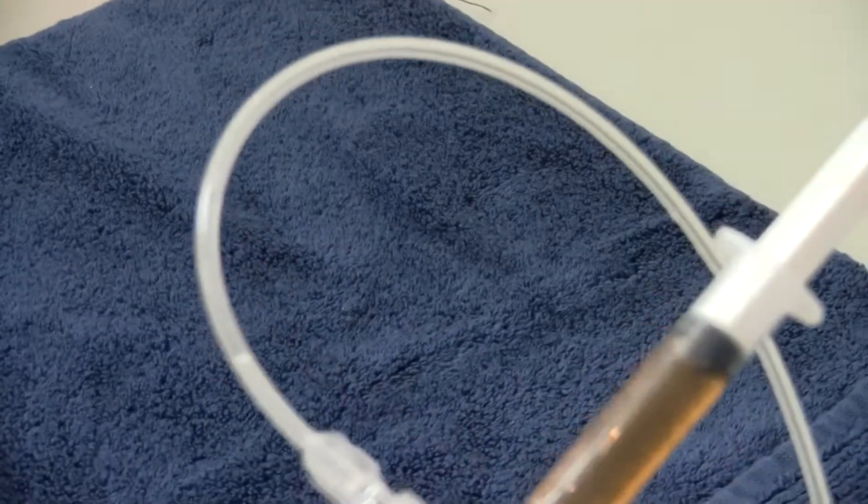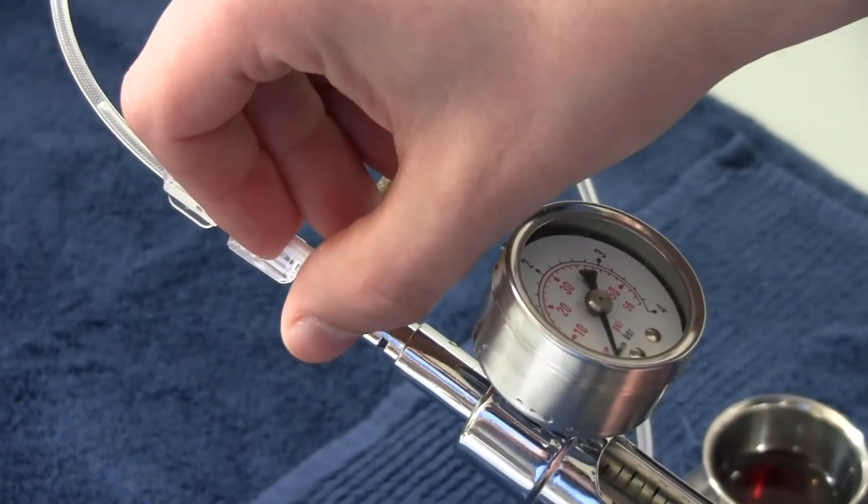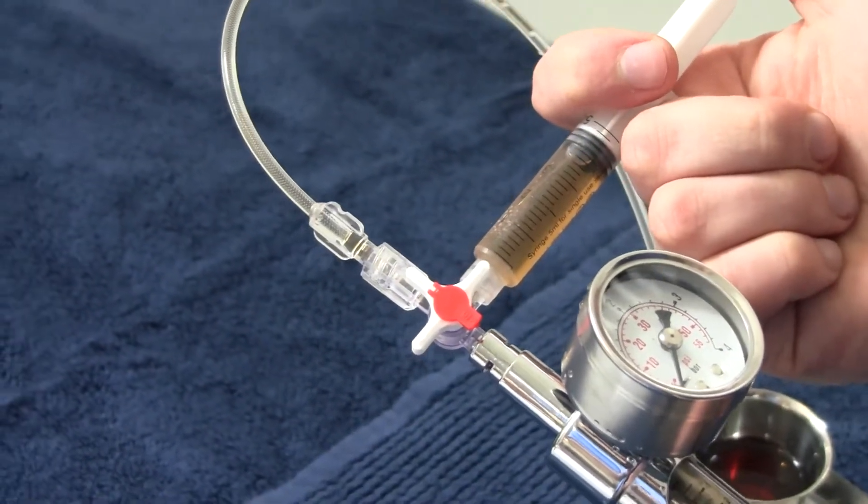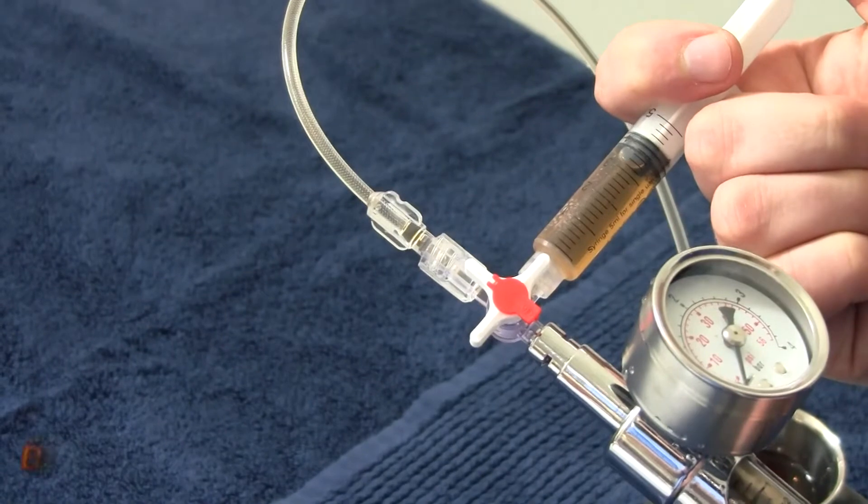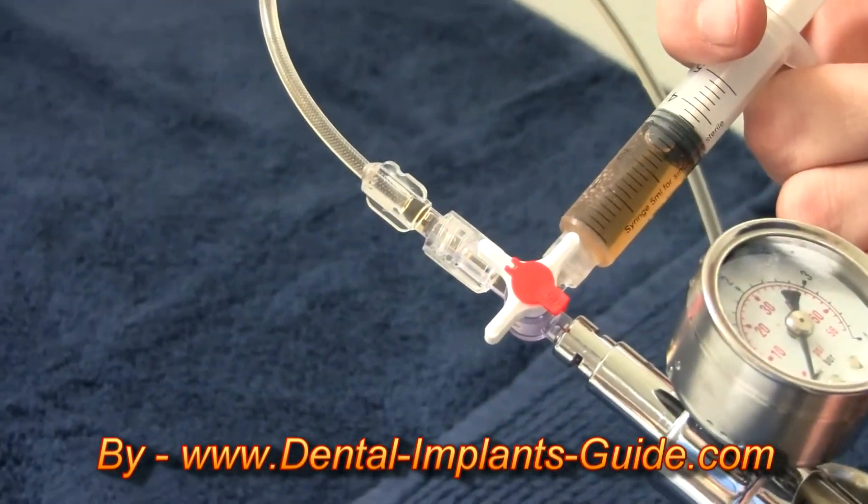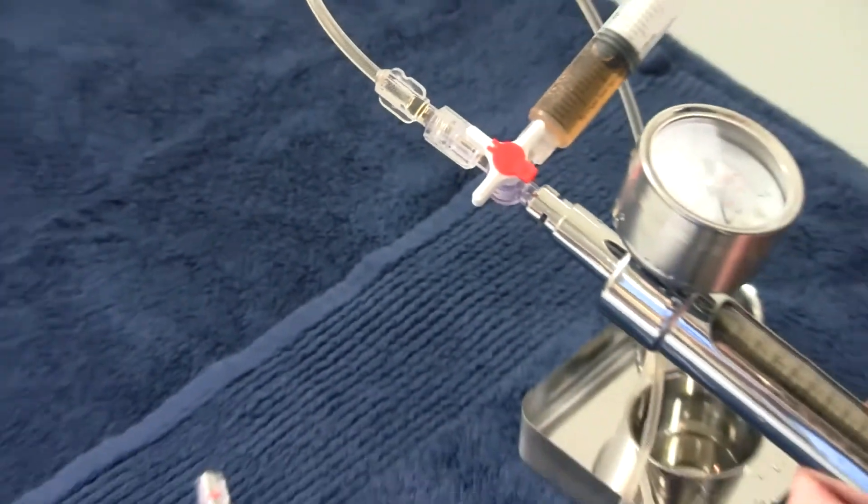Now change the direction of the flow on the stopcock to fill the tubing with contrast liquid. Make sure there are no air bubbles remaining in the tubing.